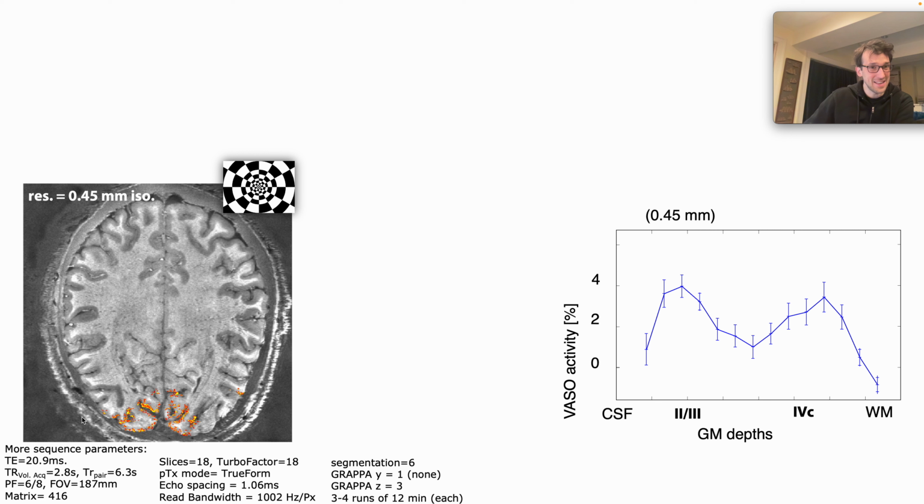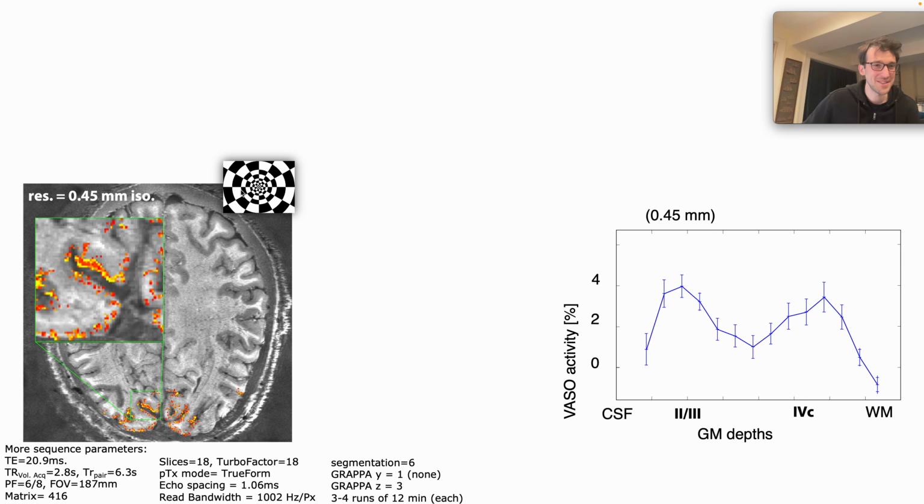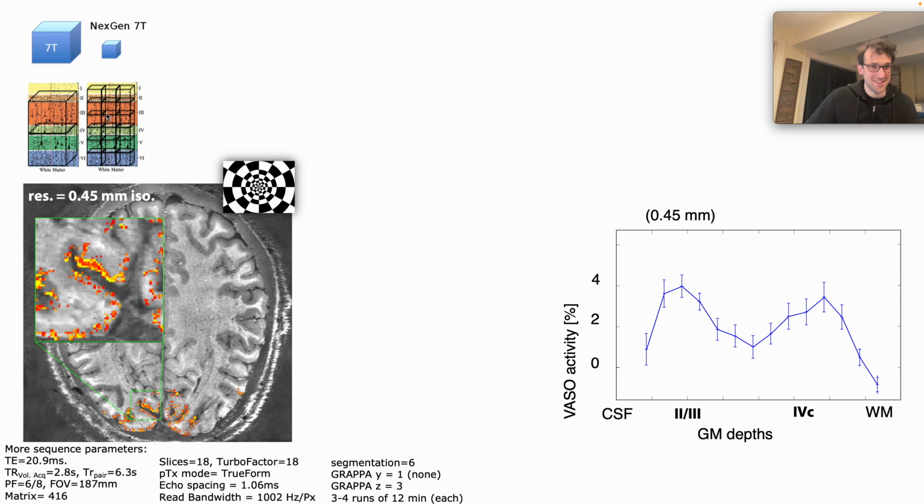And then at the end, Alex went in, looked at a flickering checkerboard for 45 minutes, and we got those kind of images, which just got me super excited because I could, for the first time at these resolutions, see that even for these thin cortical areas of the visual cortex, you see these stripes of these layer groups. I know it's wasteful to do these kind of transversal slices, even though you only care about the visual cortex with all these uninterested areas in there, but we wanted to directly see in EPI that you're looking at a brain, and also to have a feel about the sharpness of the images and to see that we indeed have 6 voxels across cortical depth as David promised in his grant.